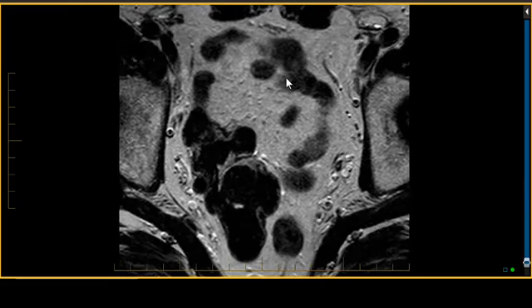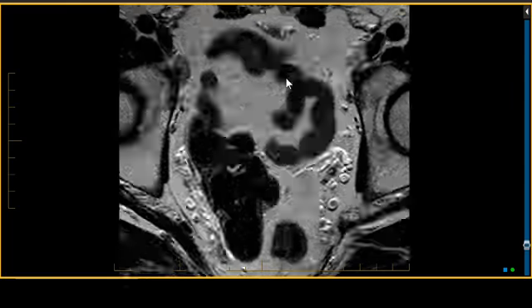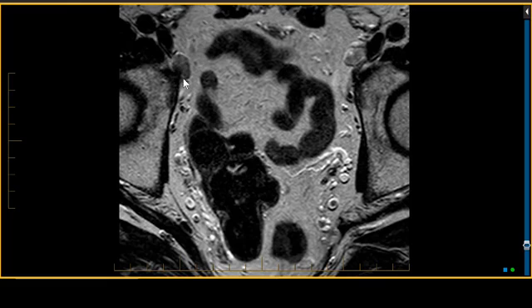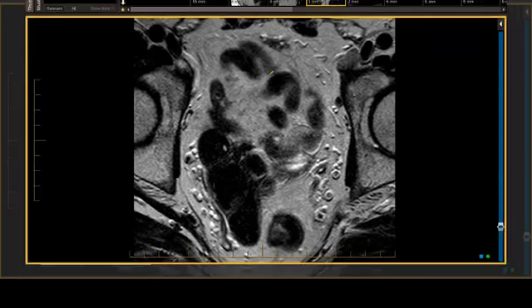But if you're very experienced, you can use the T2. Let's do that, and what are we looking for? We're looking for solid, round objects that don't have a fatty hilus in them, and they're not tubular. So let's keep scrolling, and I see some flow voids in the femoral artery and vein, and I see a gray, oval, or round structure on both sides. And it's too big, and it's too bulbous, and it's too juicy, and it's got a convex outer border. It's not crinkled. Most nodes that are benign look like this. They kind of have this crinkly look to them. And in the center, they'll have a little bit of fat. No fat, not crinkly, very bulbous, and in this case, bilateral.